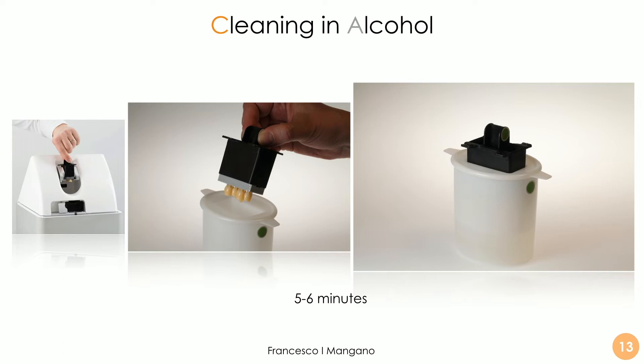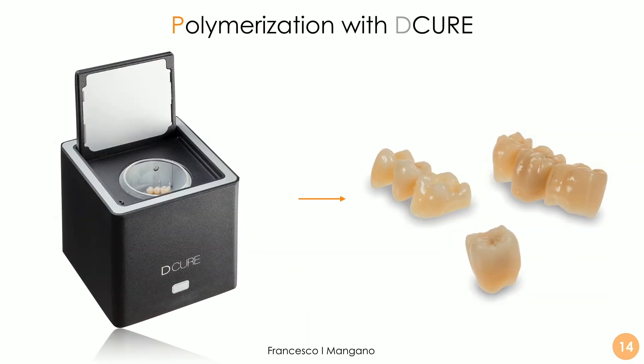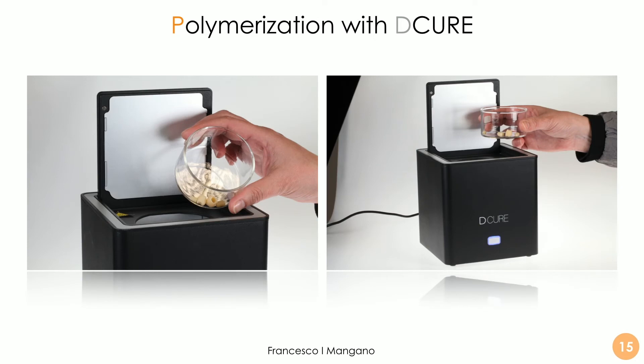We then remove the plate and place it inside the cleaning device, which is used for cleaning the restoration and for the removal of excess resin. We work for three to five minutes in alcohol to remove the excess resin. Then when everything is perfectly clean, we proceed with the final characterization and polymerization in the dedicated DECUR device — the DECUR device that is used for polymerization.